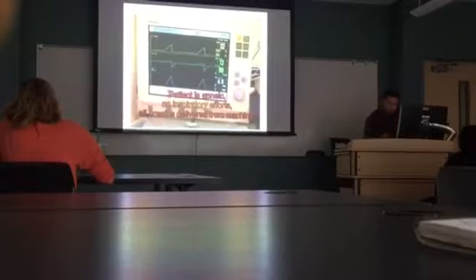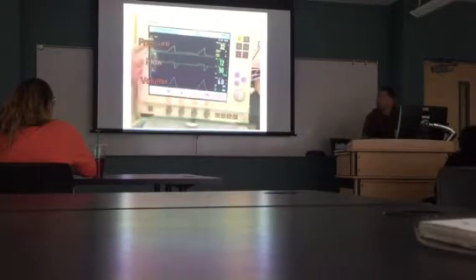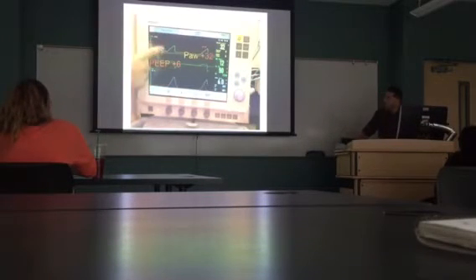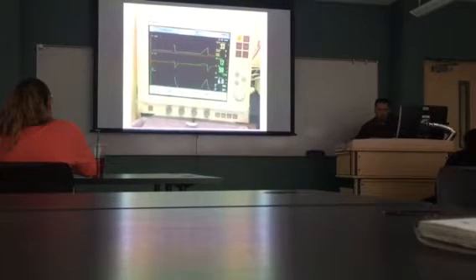So that's the volume control mode for a patient that would be happening. Pressure and flow, we do not see any patient efforts being taken. And in the event that the patient starts waking up, you will begin to see some triggering.